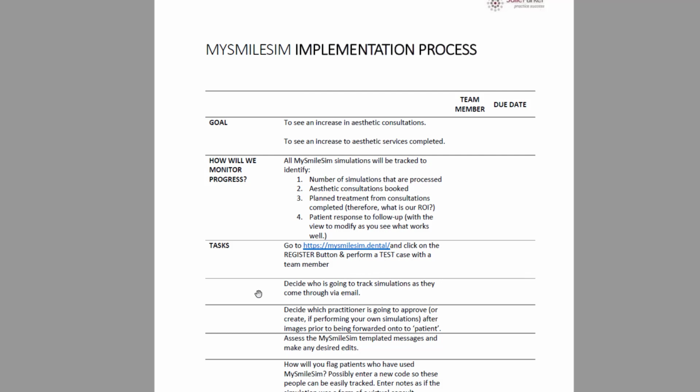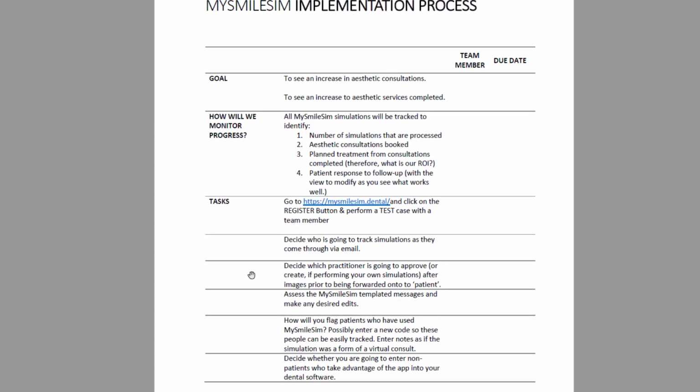The next task I suggest you do is decide who is going to track simulations as they come through via email. That could be the receptionist, it could be the practice manager, the treatment coordinator, or one of the dentists. Also, decide which practitioner is going to approve, or if you guys are doing the simulations yourself, who's going to be doing the simulation after the images prior to being forwarded onto the patient.